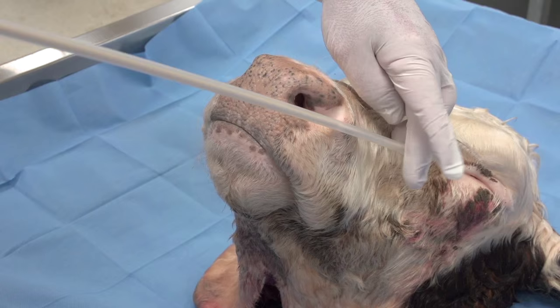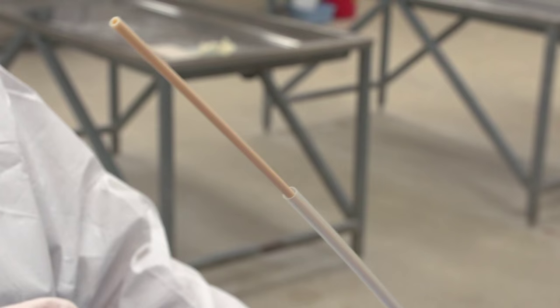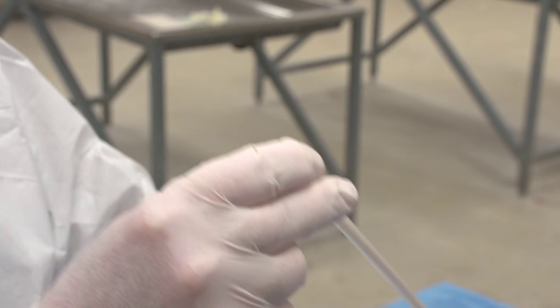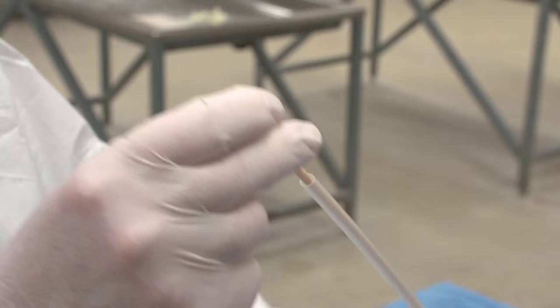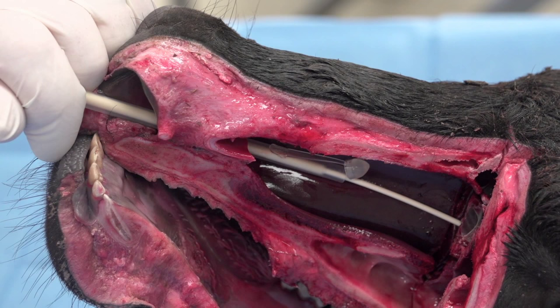To begin the procedure, gently insert the guarded swab in either nostril until it is approximately halfway between the external nares and the medial canthus of the eye, or until you encounter resistance. Forcing the swab past resistance may cause bleeding. With that location reached, advance the swab forward through the guard. Now move the culture back and forth approximately 10 times. Some bacteria, like mycoplasma, are tightly associated with mucosal cells, so it is important to take the time to collect a representative sample.